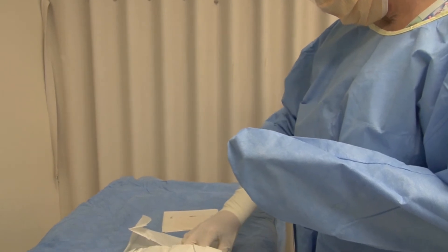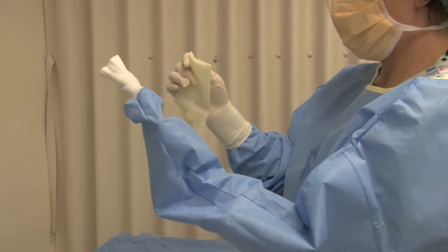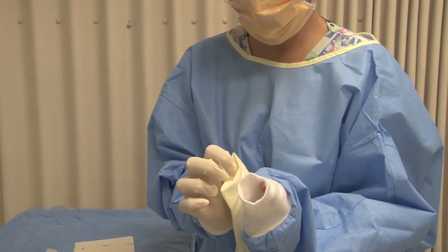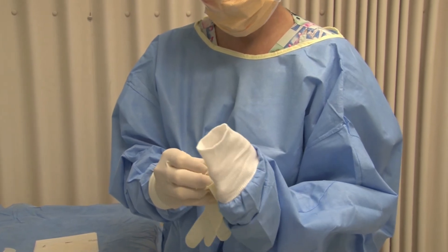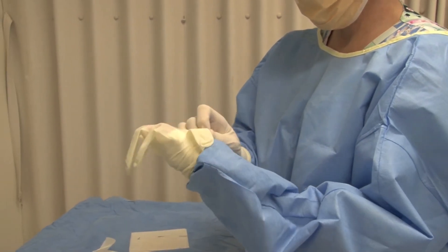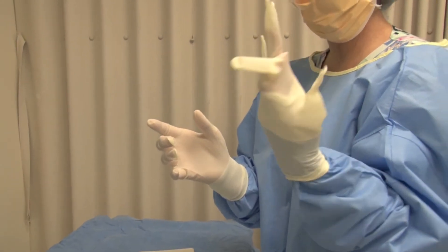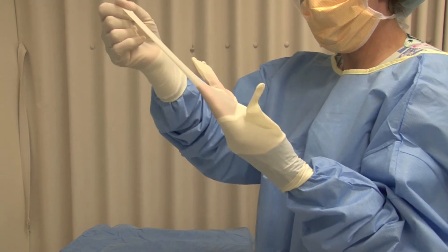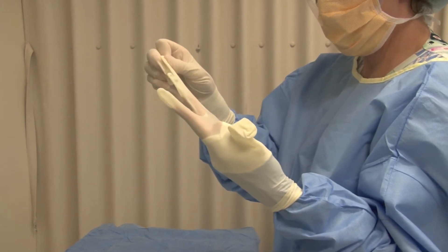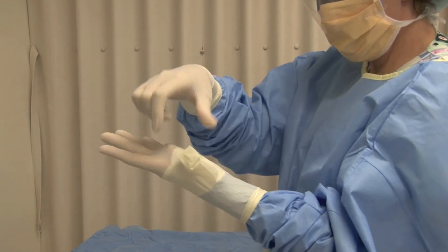I'll do it again for the left-hand side. You can see me reach inside the packet and pull out the glove — there's the thumb piece. Thumb to thumb, flat side to flat side, and put your fingers in. I can pull that piece out for you so you can see my fingers go down into that space and I pull this down so the cuff is covered. I like to pull the cuff down, and then — you can see my fingers haven't gone into the glove — so grab the end, pull it, and your finger will drop in.